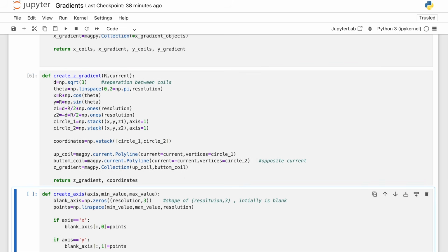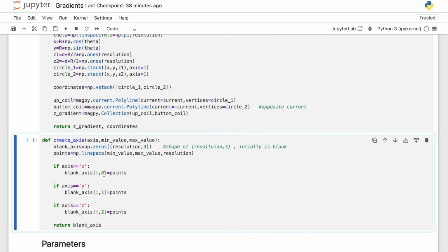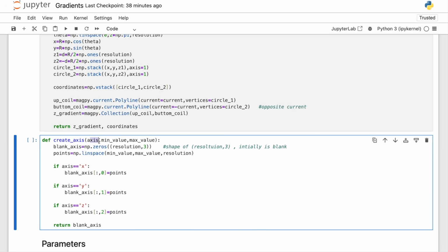So let's run this as well. And then here we have a last function, which is just creating an axis with minimum maximum value in a desired direction. This is just needed to plot the magnetic field in a desired axis. Let's say if we want to plot it in x-axis, we'll have the blank axis populated accordingly. In a similar way, we can just choose y or z axes. We'll see this being used when we plot the magnetic field.